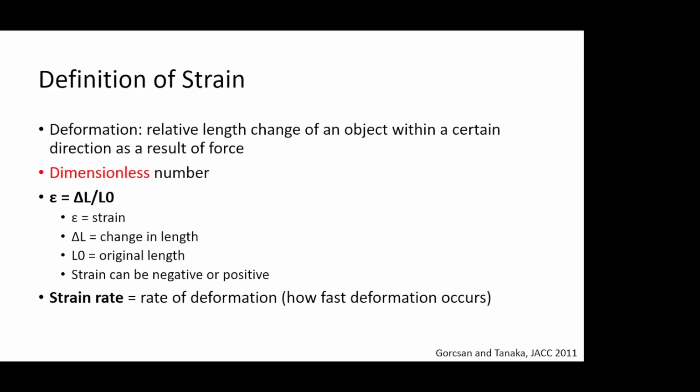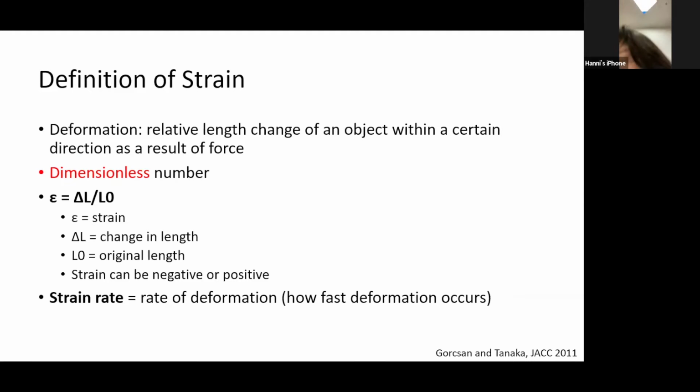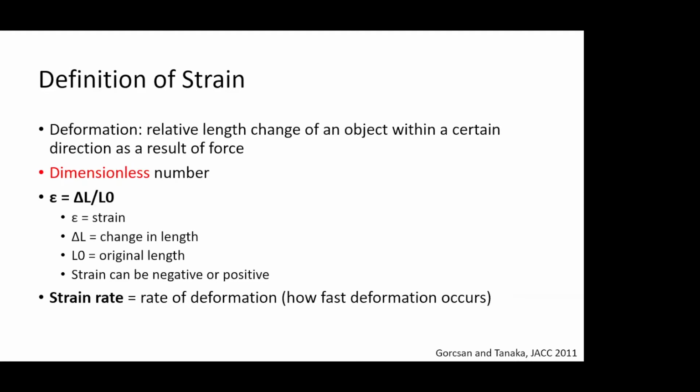So I'll first start off with what the definition of strain is. Strain is really like a physics term as well. It's essentially equivalent to deformation, which is often discussed in the same vein as strain. And essentially it can be applied to any object where there's a relative length change in that object within a certain direction as a result of some force.